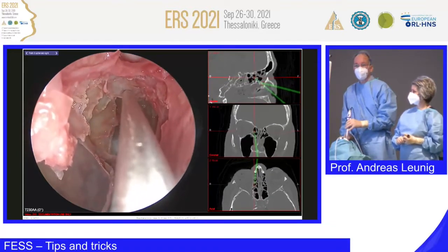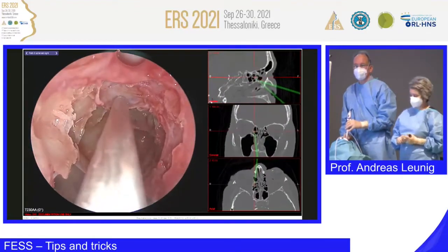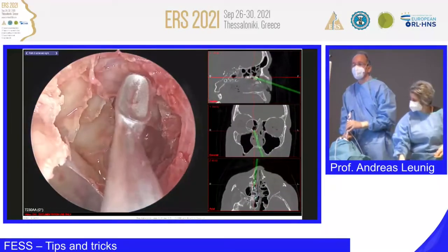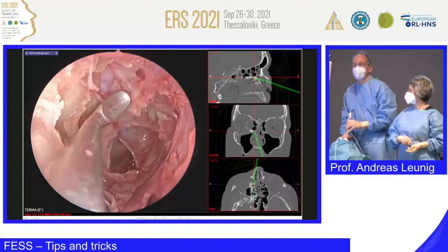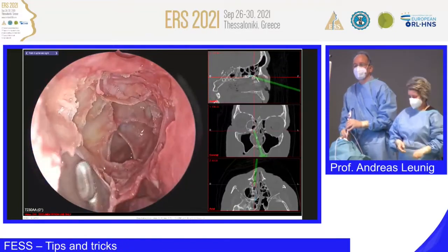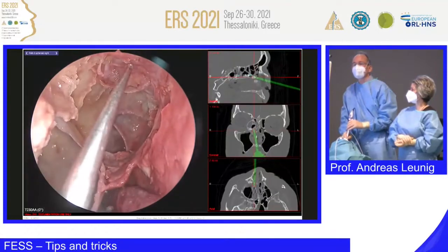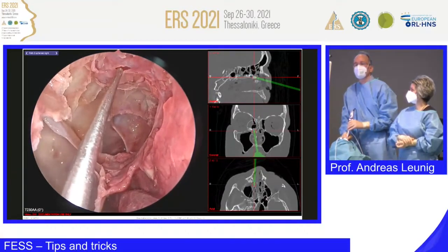And before entering the dura, I would stop, okay? But, yes, you want me to show it? Okay, you want me to make a CSF leak? Okay, the Kuhnspoon would be my first one during a dissection. Okay, no, we have a look here. Maybe you're right, what do you think? No, nice, isn't it? Maybe you're right, I'm not sure. Gib mir mal die dünne Sonde für die Stirnhöhle. But you know, that's one of the good things during dissection, because I don't know, you don't know. Navigation showed me, but do I really trust navigation? Yes, I do, but at the end, I'm responsible for what I'm doing, okay?